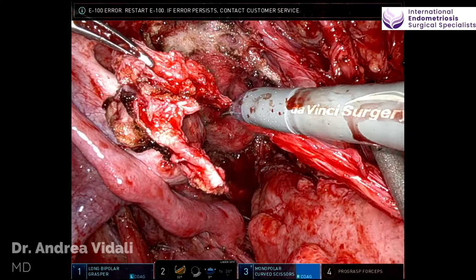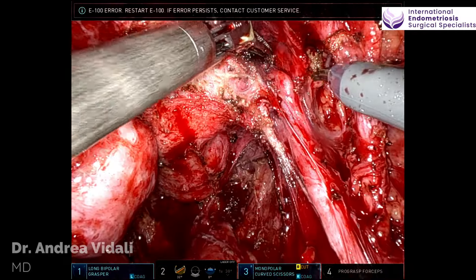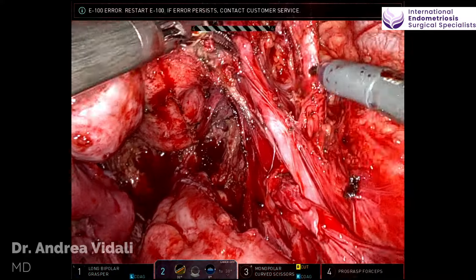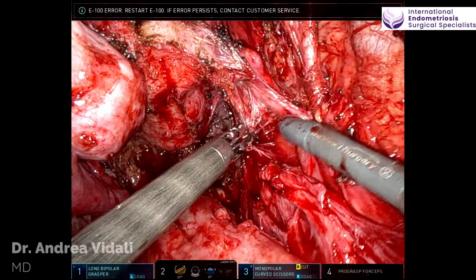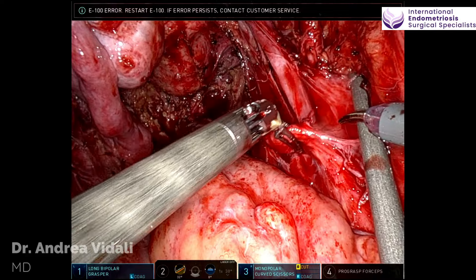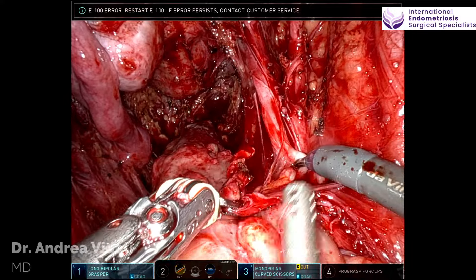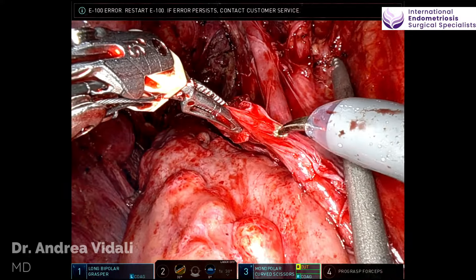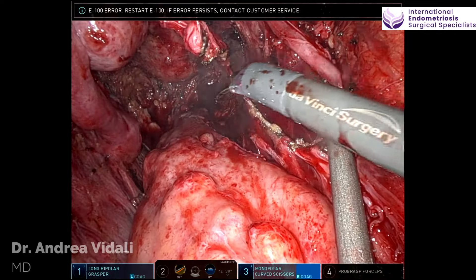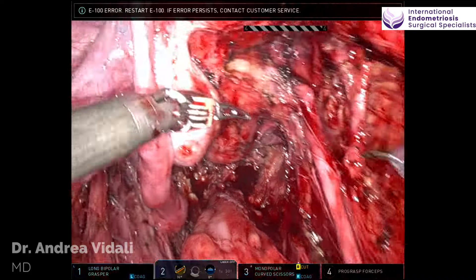As we proceed with the dissection, now that the right pelvic side wall is completely clean of disease and you can see the whole anatomy at this point, we dissect the ureter further while still preserving the fascial layer that contains the hypogastric plexus.